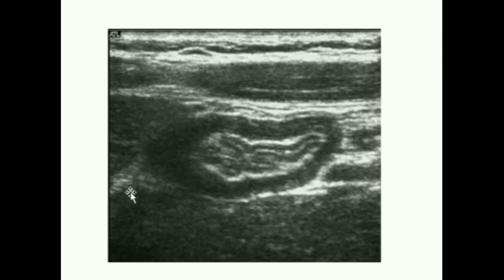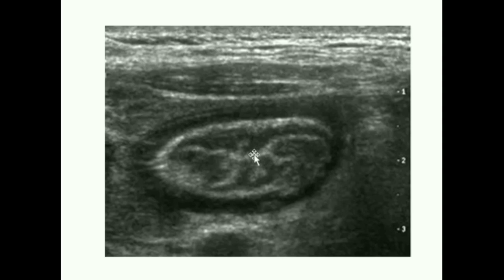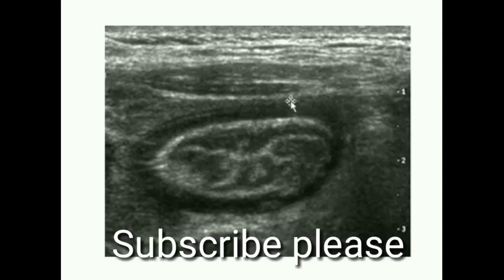This is the image of the normal gut. We can appreciate the interface between the lumen and the mucosa, the mucosal layer, the submucosal layer, the muscular layer, and also the serosal layer. This image shows the interface between the lumen and the mucosa, the mucosal layer, the submucosal layer, the muscular layer, and the outermost serosal layer.